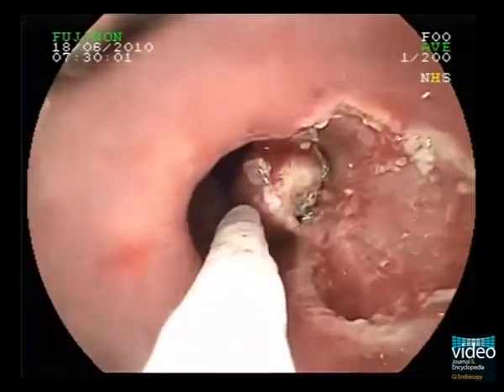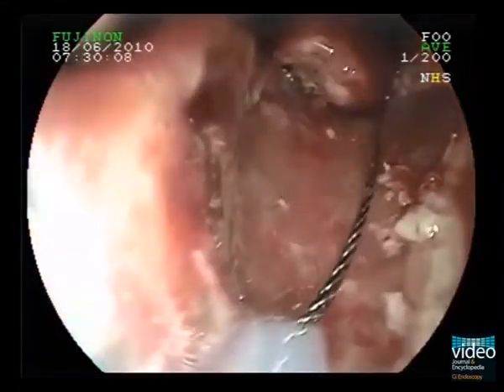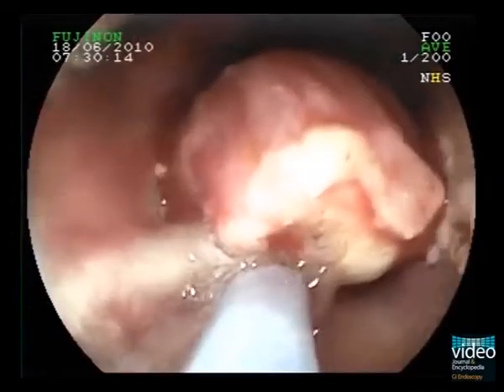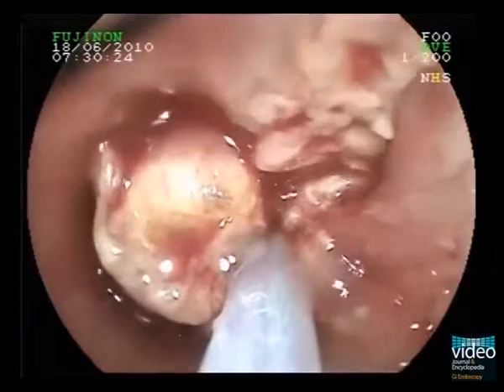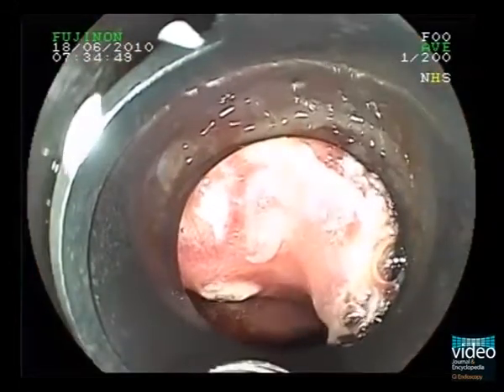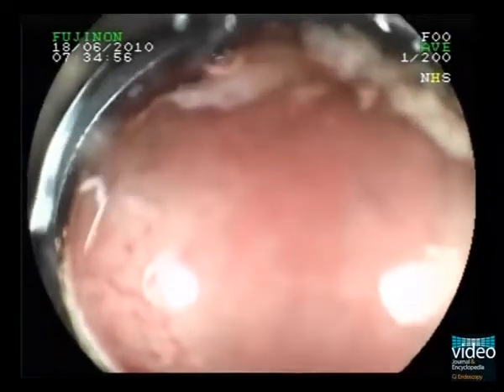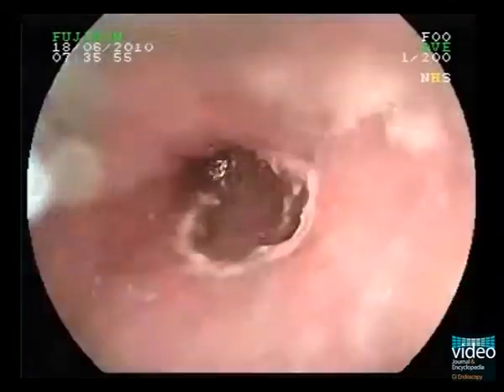A second ligation was performed. Make sure that there is a slight overlap to the previous resection site to avoid mucosal islands or bridges with neoplastic tissue left behind. On the other hand, it is very important to avoid larger overlap because the muscularis propria of the previous resection site can be sucked into the ligation device, resulting in a perforation after resection.